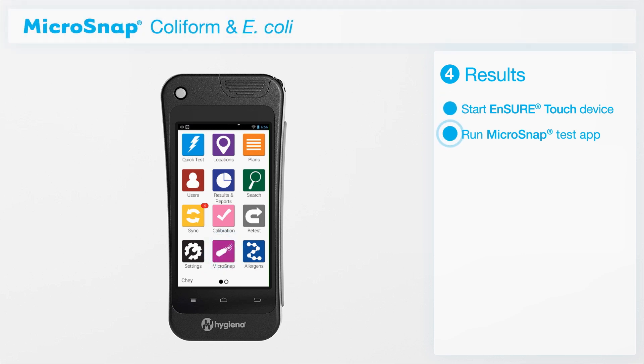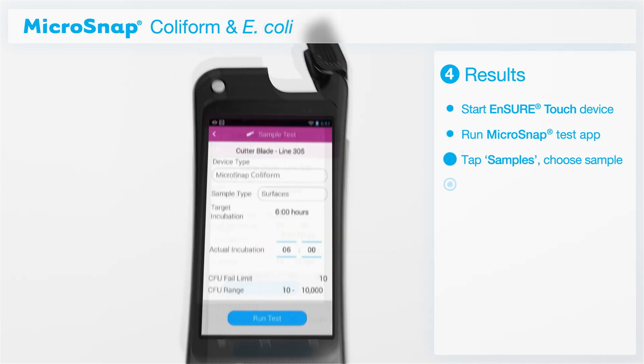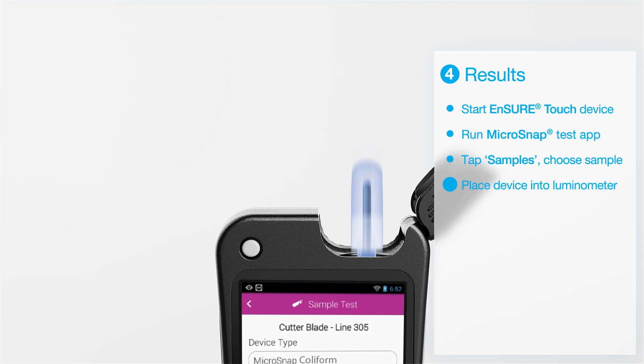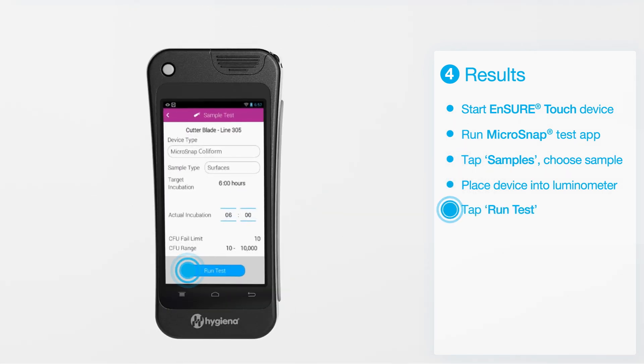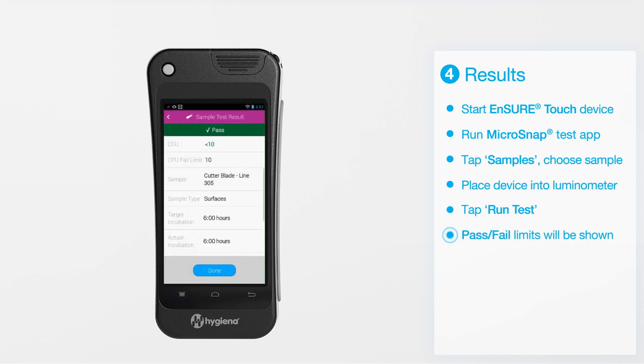Set up your sample testing parameters in accordance with the Ensure Touch instructions. Initiate the Microsnap app. Simply tap Samples and select your sample type. Insert the detection device into the luminometer, and tap Run Test to initiate the testing procedure.